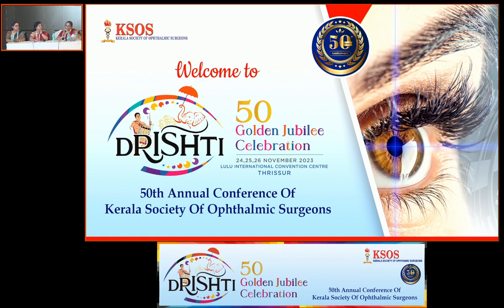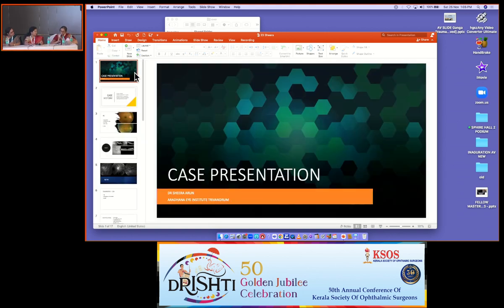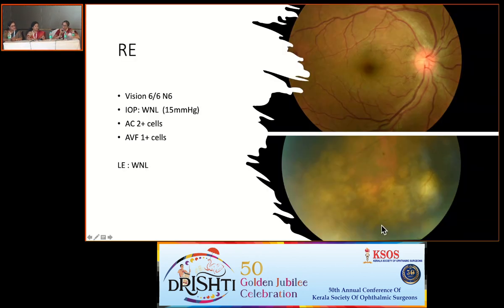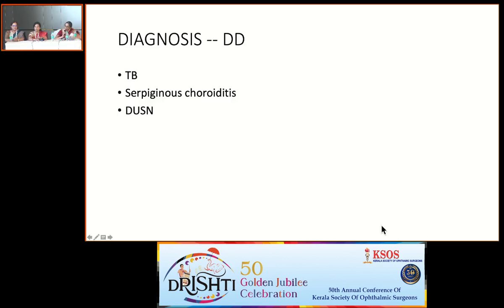One thing is, the DUSN in its acute phase has a clinical picture which is very different from its late phase. It's very important to recognize the DUSN in the early stages. And the cases which I've seen, they generally get much smaller lesions, either in clusters or in tracts. It's very unusual for them to get choroidal elevation like this. Please go back to the next fundus picture.